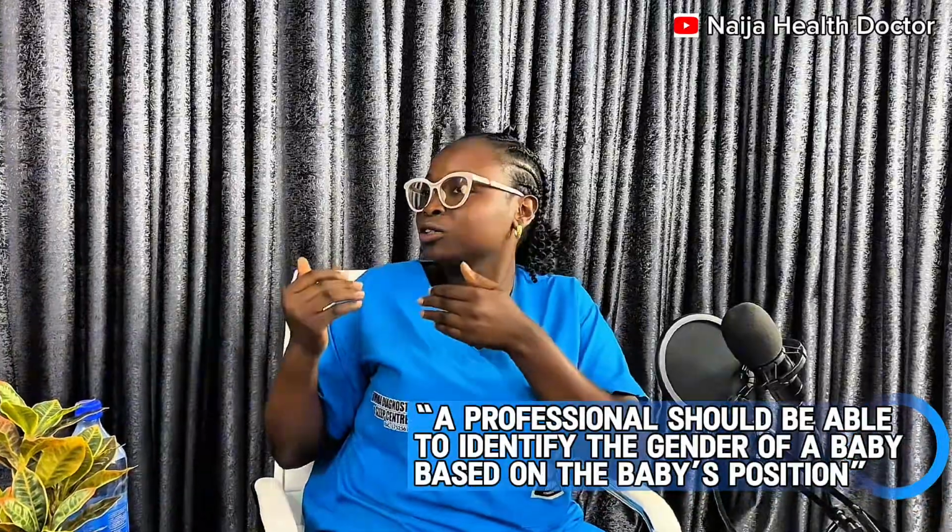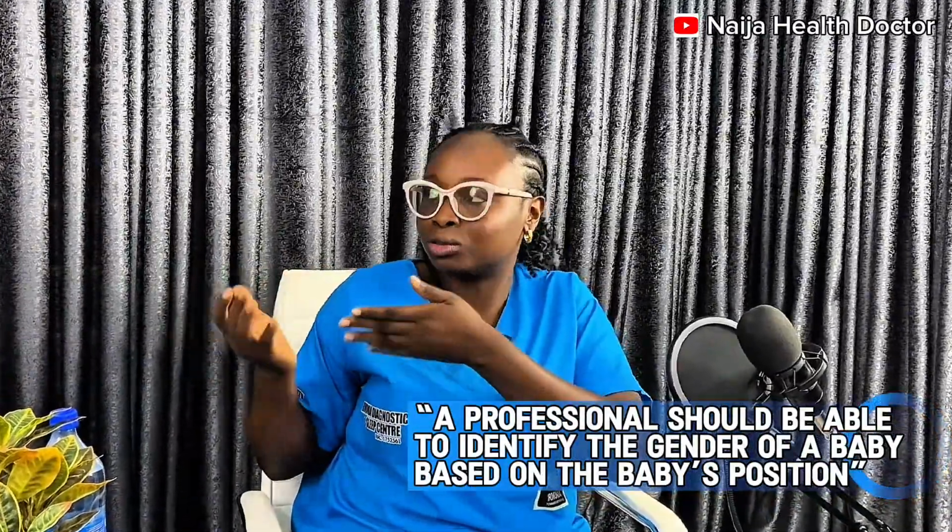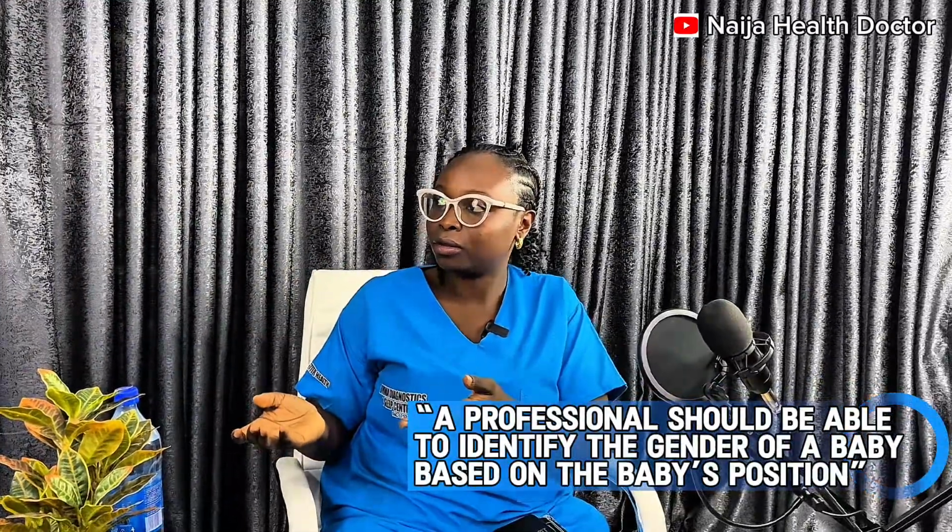Though they'll say they want to see the gender clearer with the baby's position. A professional should be able to identify the baby's gender, but those things depend on some factors, like the baby's position. The baby's legs might be closed, and you might not be able to capture the genitals well. 3D is static, so 4D is just 3D showing movements, and it's clearer than 3D. It's like real life.